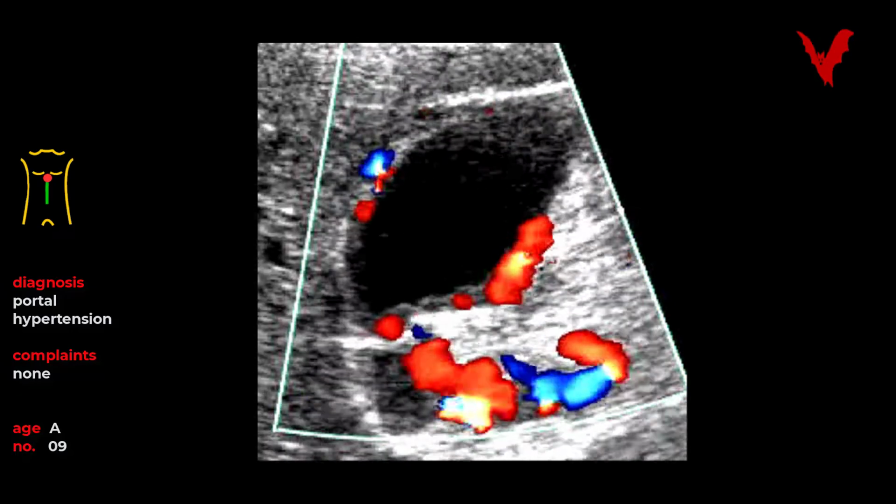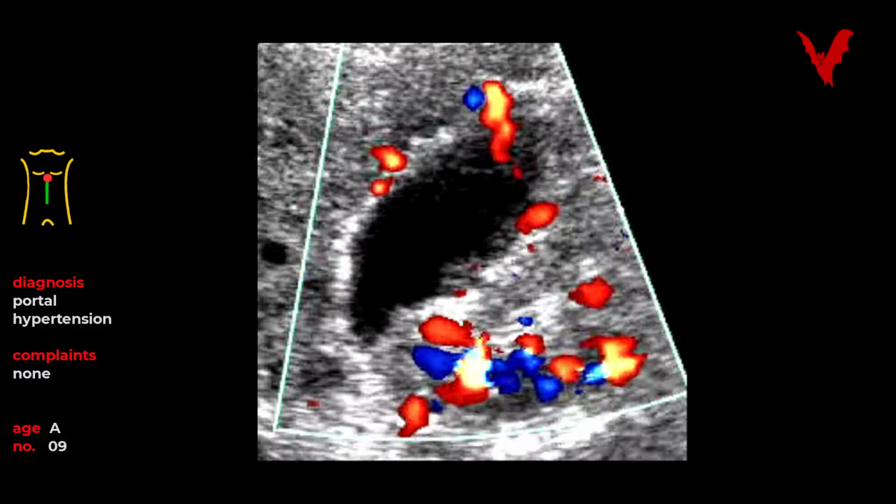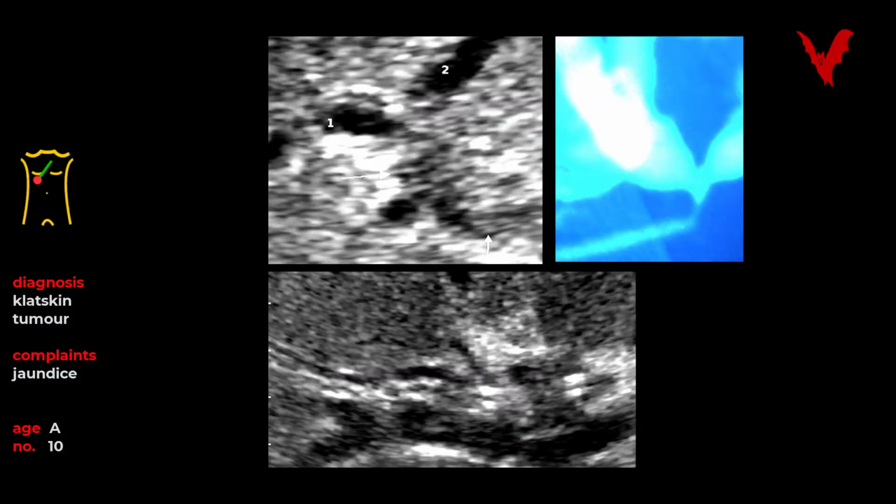In figure 9 one finds vividly perfused gallbladder wall varices. This biductal stenosis in figure 10 shows from the very beginning the need for double stenting, and this was of course controlled as well by ultrasound.